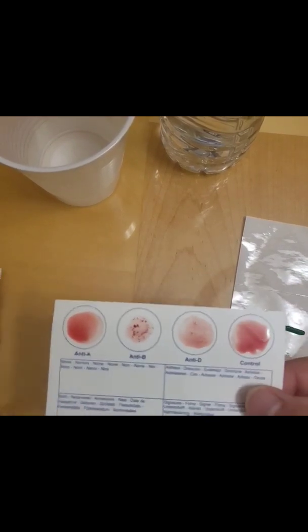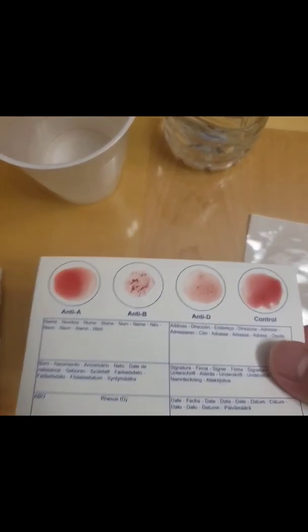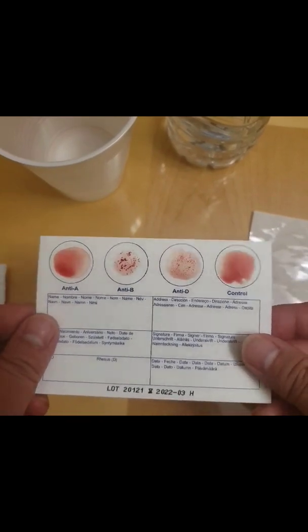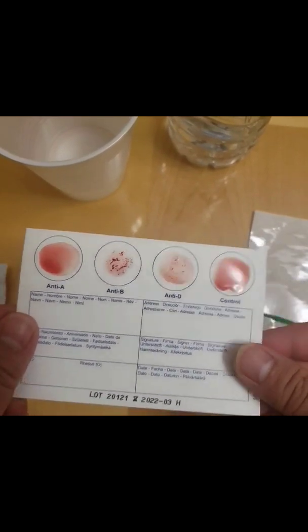Tilt the card to an almost upright position. Don't stop when you see the first reaction.